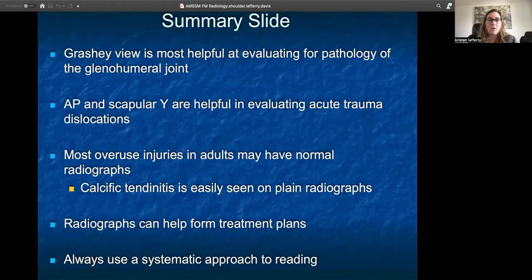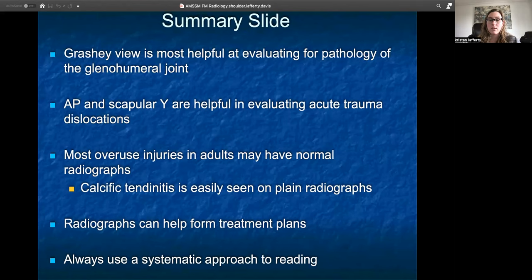In summary, the Grashey view is the most helpful in evaluating pathology of the glenohumeral joint. AP and scapular Y are helpful in evaluating acute trauma episodes like dislocations. Remember that most overuse injuries like rotator cuff tendinitis, tendinopathy, and impingement may have normal radiographs, but it is still worthwhile to look at your radiographs because it helps with diagnosis. Sequelae of these overuse injuries like calcific tendinitis are easily seen on plain radiographs. Radiographs can also help us form treatment plans — anyone with chronic or acute pain may benefit from x-rays. And do not forget to use a systematic approach to reading x-rays of the shoulder or any joint, so you don't miss anything that could explain patient symptoms. Thank you for listening.